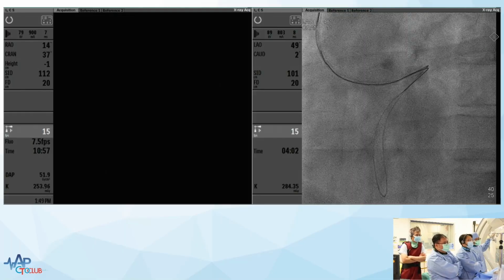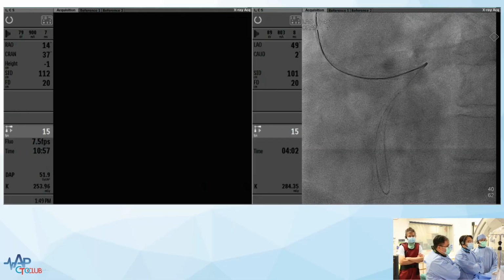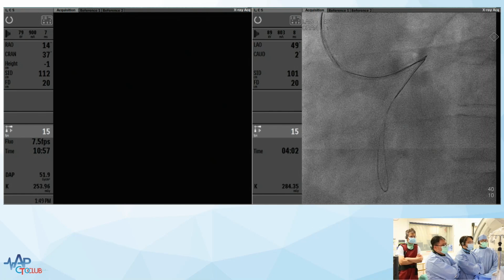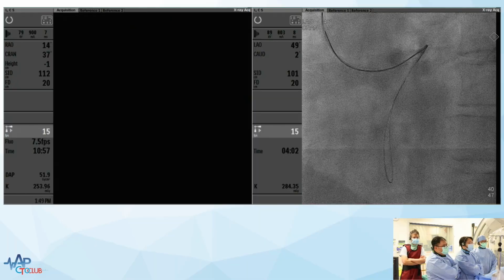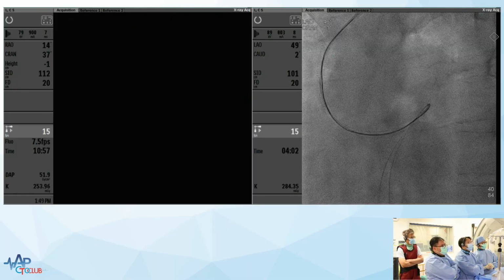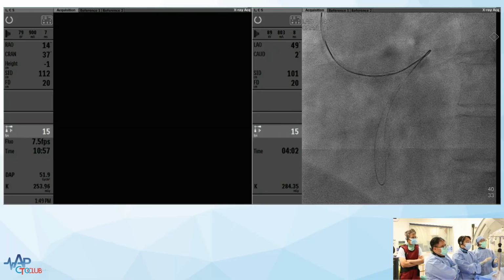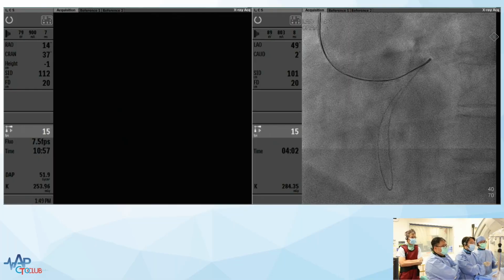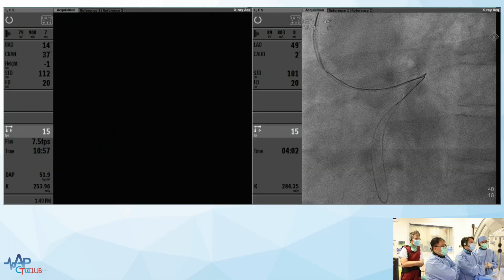It's around 15 minutes. And then I think one of the important parts of a tip-in, right, is the advantage you had here is that you just had that single short bend on the UB3, right? Once you have a bigger bend, yes, it is very hard to do a tip-in, right? Yeah, another point I want to add about why we use this method is that, to be honest, when I wire the CTO body with the UB3, I don't need any force. And I think that the plaque is quite soft. It's just like a workhorse wire, it just goes through without much manipulation.